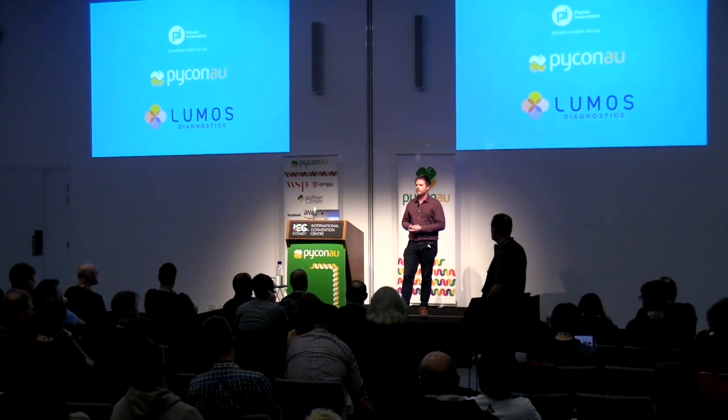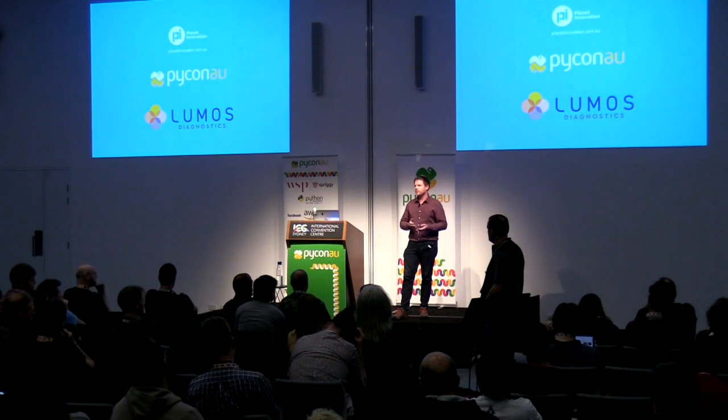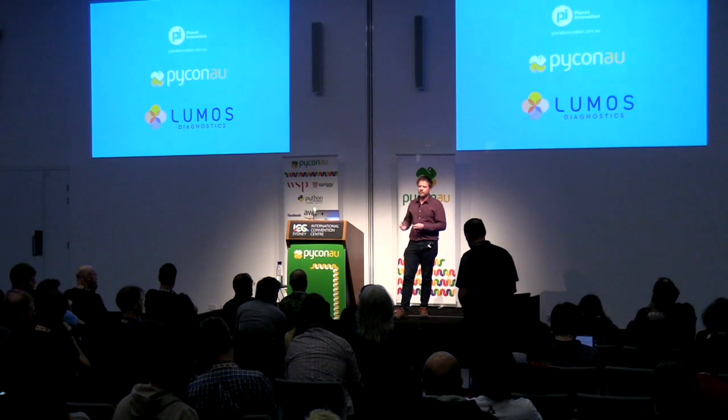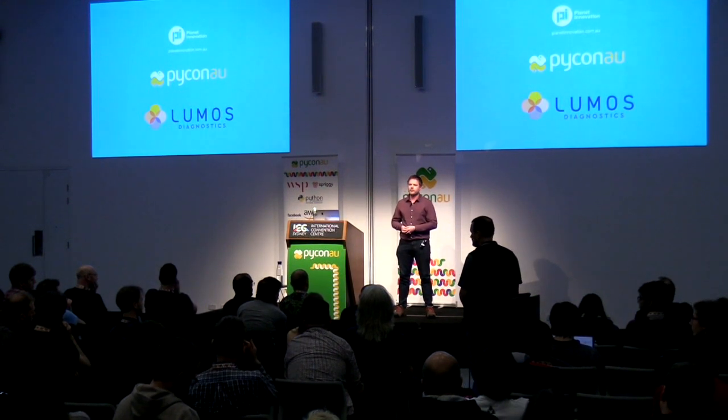The USB is a good example too. In normal operation, the USB interface isn't actually being used. In our case, if the USB is plugged in, it basically puts the unit into a different mode, either for charging only or for development use. So when it's actually running an assay standalone, the USB port isn't being used, to prevent those sorts of interactions.